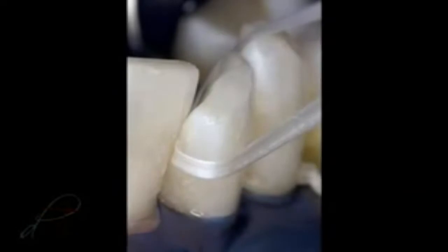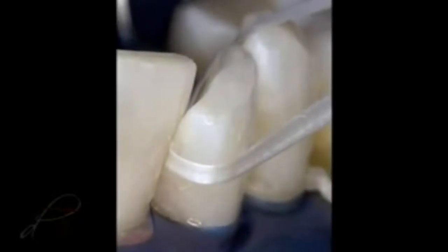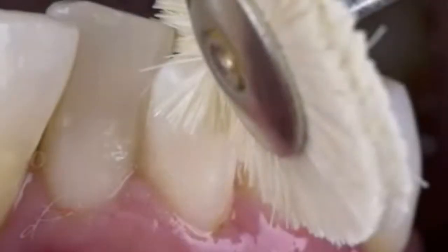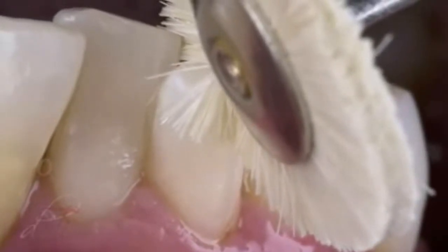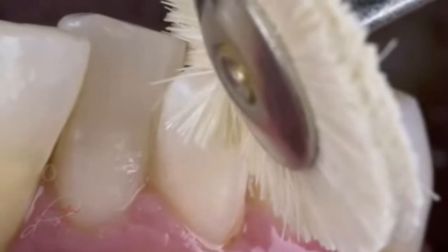The proximal surface was inspected for adequate contact with an unwaxed floss prior to removing the dental dam. After the dental dam was removed, a definitive luster and surface reflectivity was accomplished with a goat-hair wheel and diamond polishing paste using an intermittent staccato motion.